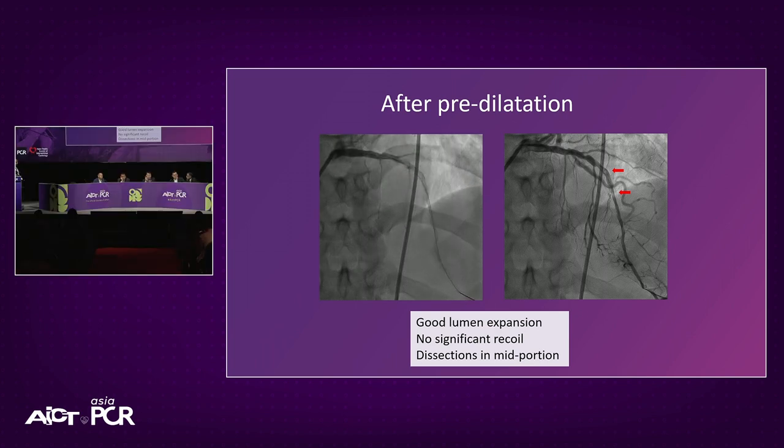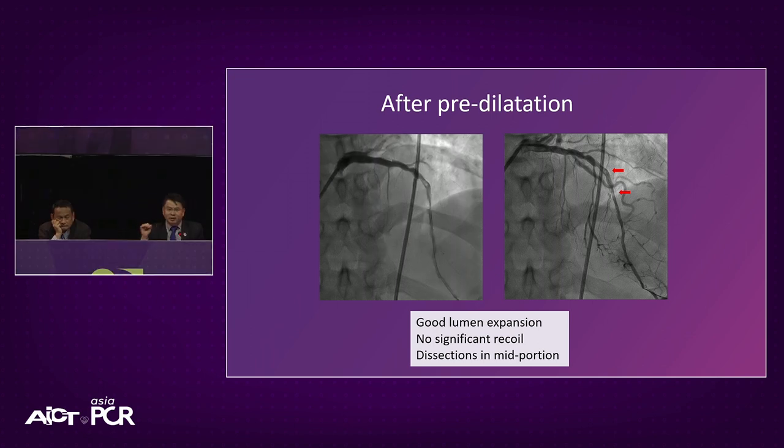So now the question for me, I'm going to ask Chiyang followed by the IVUS eyes here, is you're going to put in IVUS. Obviously, you already have the IVUS. What on IVUS would sway you to cover your stent? And what angiographically convinces you that this is okay without IVUS, Chiyang? Yeah, okay.